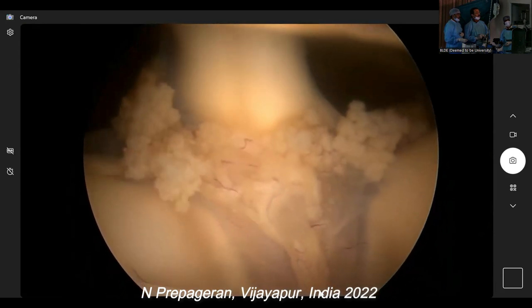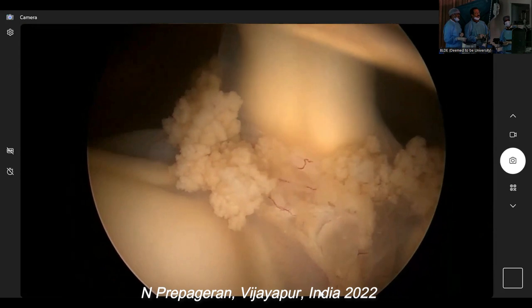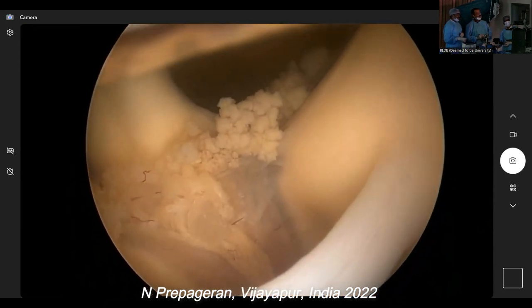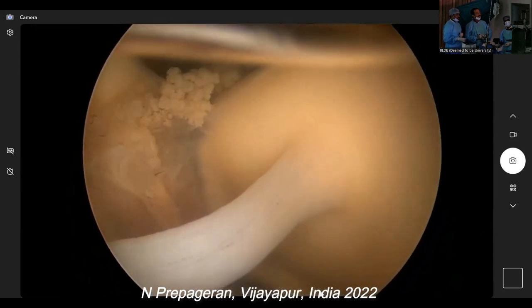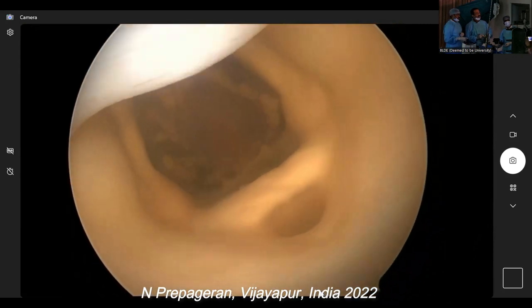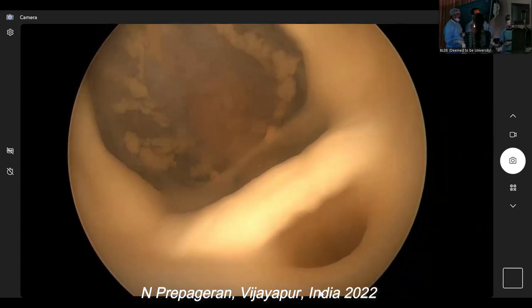There. Lateral recess, right. Lateral recess, left. Very nice. Foramen of Monro. That's, I think, the interpeduncular cistern. Ah, aqueduct of Sylvius. Yes. Fourth ventricle. Can you guys see that?